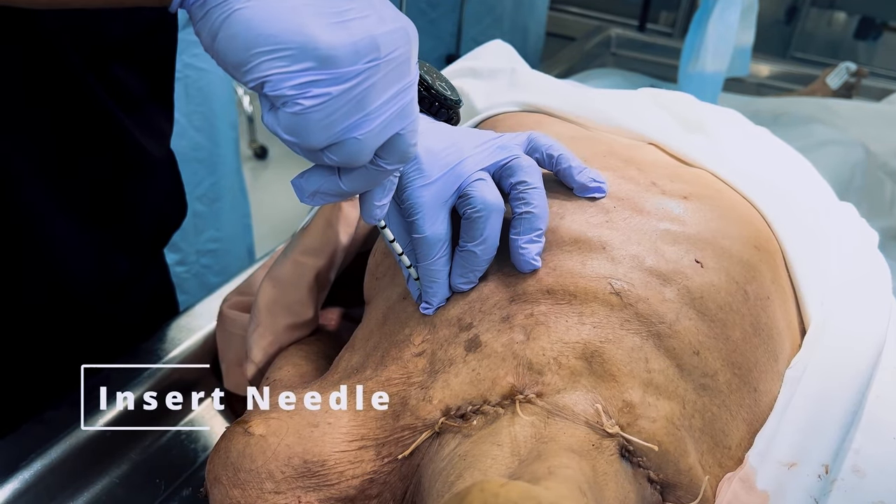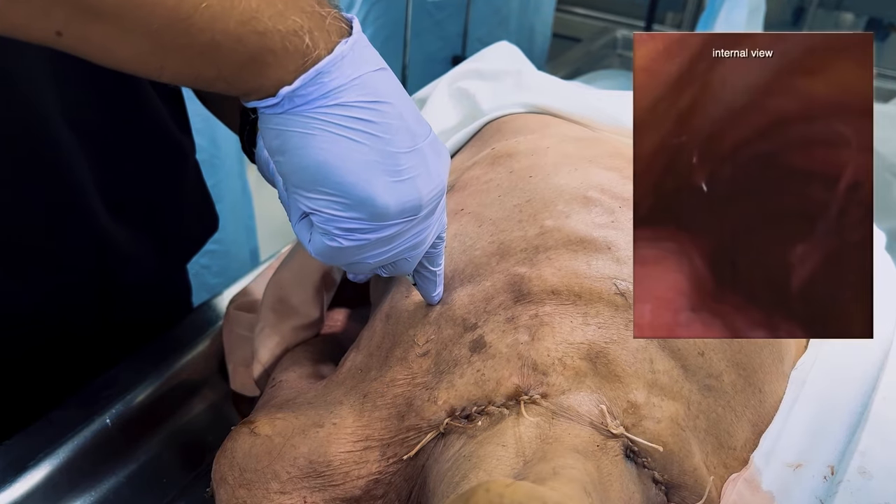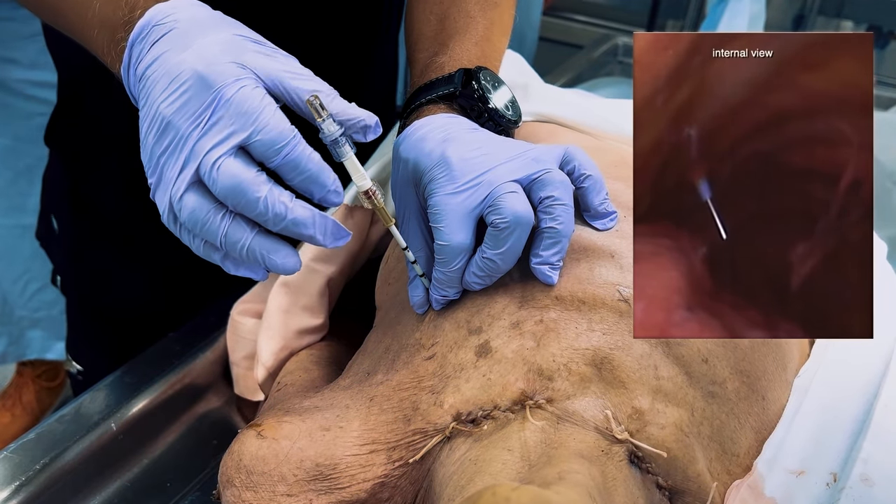Insert the needle into the skin and adipose tissue until contact is made with the rib. Then measure and hold the needle at three centimeters above the skin.